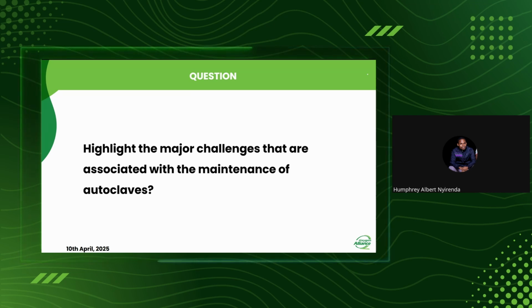So when there is an issue with the earthing, and you have an instance where one of the live wire, the earth or the neutral wire is touching the chassis of the equipment, it means the whole equipment will be carrying a voltage or power. Then when somebody touches it, it creates a path through resistance. So the current has to flow through her body. So that's how she experienced shock.